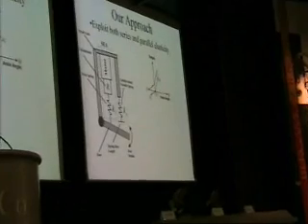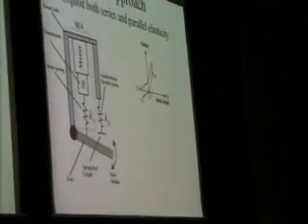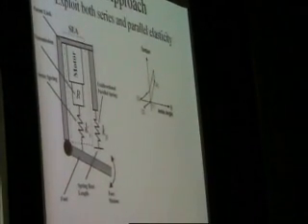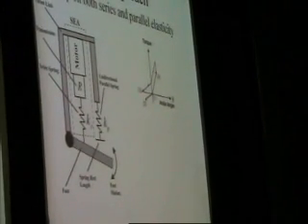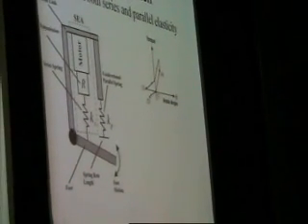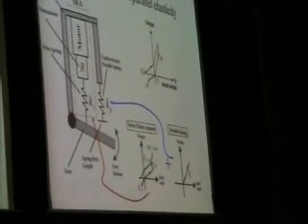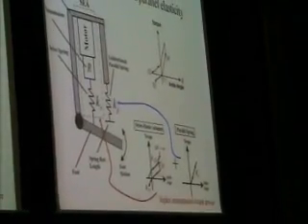The series spring is like the Achilles tendon, it represents the tendon. And in parallel to that actuator system is a spring structure that represents the ligaments that span the human ankle. With that architecture, we're able to generate very high torques and very, very high powers.